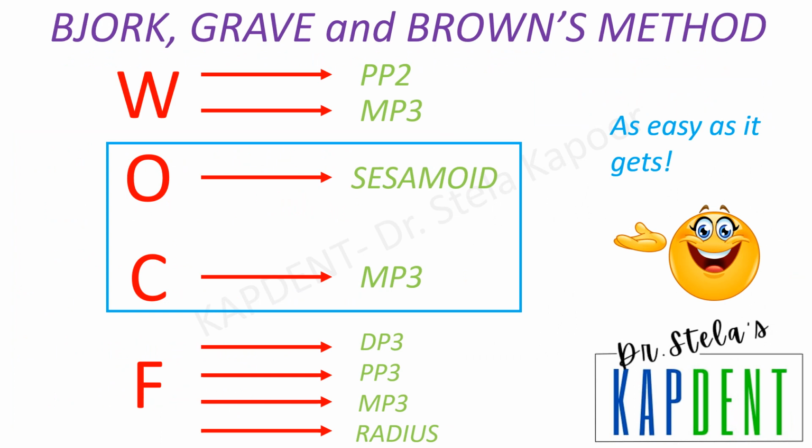If you have understood the sequence of the ossification progress in the previous slide, now I present to you the 8 stages according to Bjork, Grave and Brown's method. So the 4 stages are WOCF, which I presented to you in the form of a mnemonic or a short form, and adjacent to it are given the growth sites. Now that is something which you will have to learn and mug up, and I'm sorry, I really sympathize with you on this, but this is as easy as it gets. So now you may take a screenshot of this chart as well.